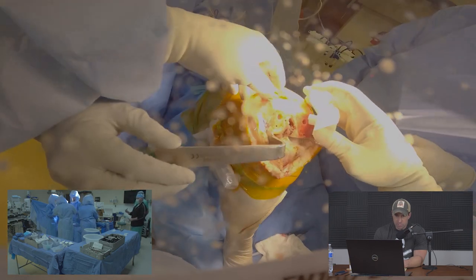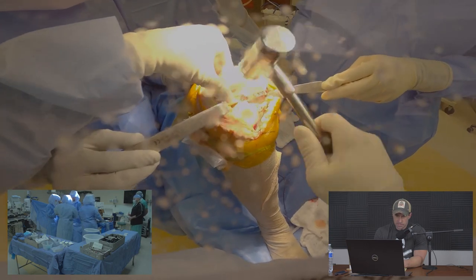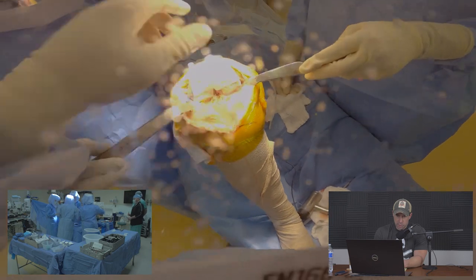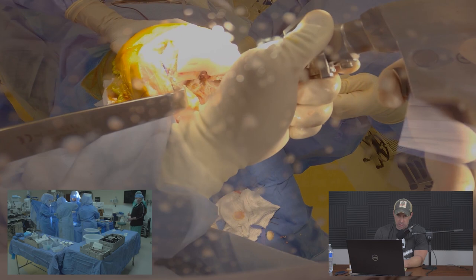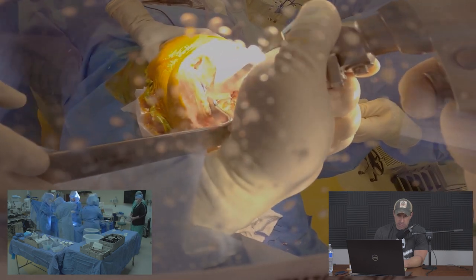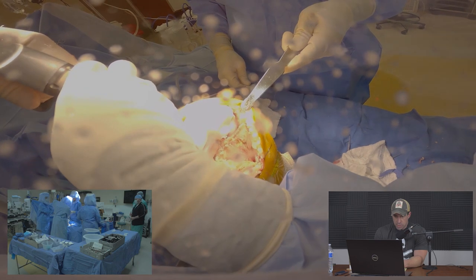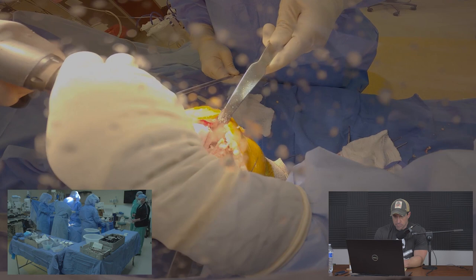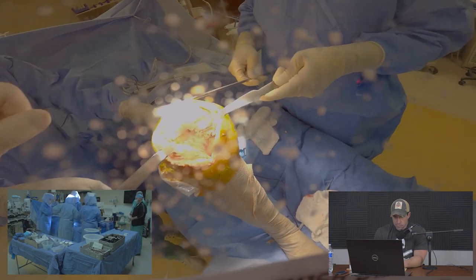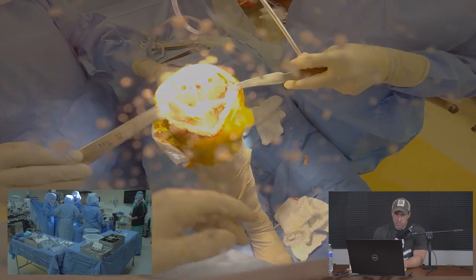This is the F5 block. Normally there is one posterior chamfer cut, but this custom design has two chamfers, so I make two cuts on each side of the knee. We then remove that block and clean up bony debris.